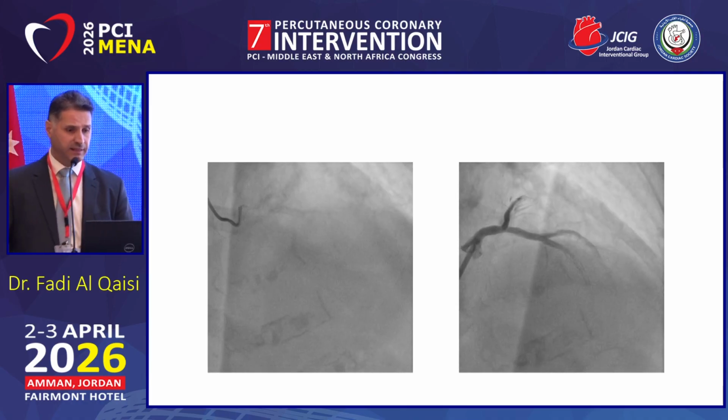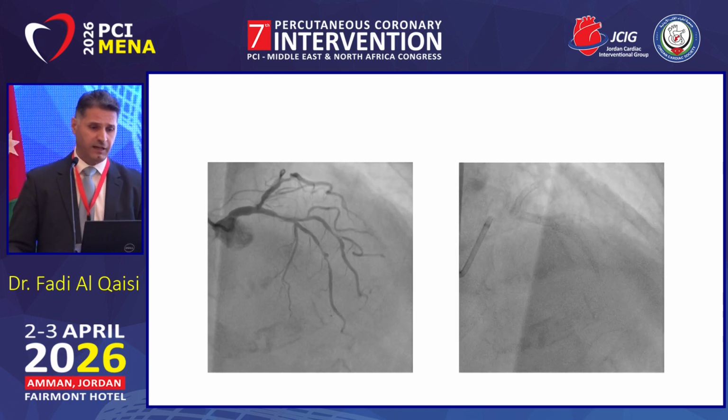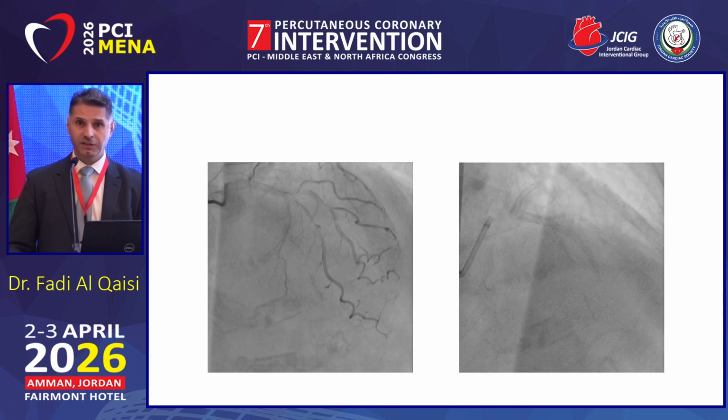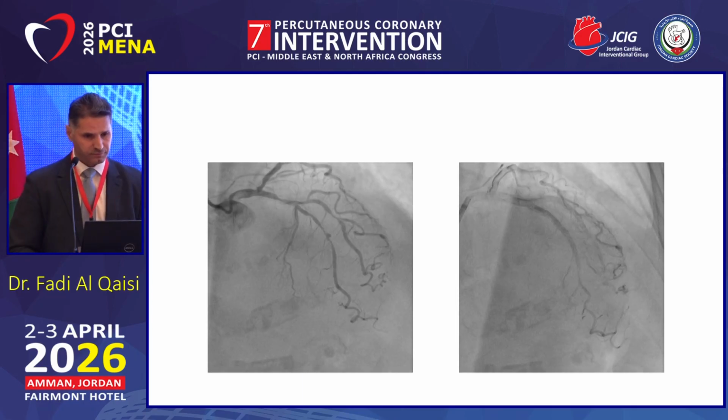This is one of the cases that I did in Jordan. You can see here, I used the same balloon. I went around on the LAD, on the diagonal, on the left circ, a little inflation here and a little there. But it was very cost effective.